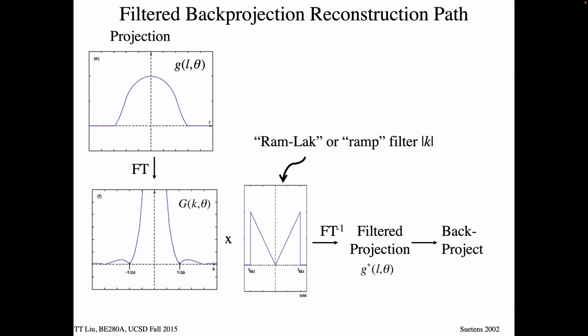This is where it gets tricky. If it's not set up perfectly, if your data is offset a little bit from the optimal discrete sampling, then you will see ridiculous Gibbs ringing off edges, and we'll see some examples of that. So it gives you the analytically correct image, but as we'll see, filters like this come with problems.